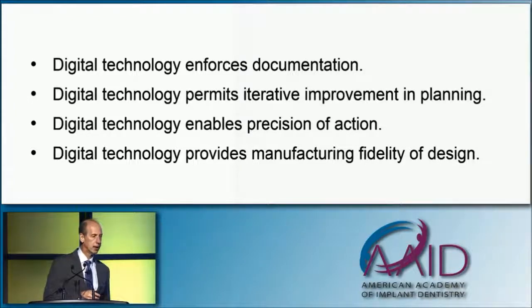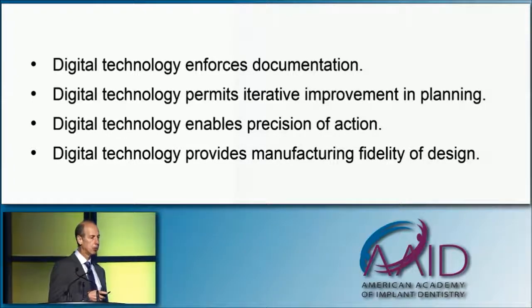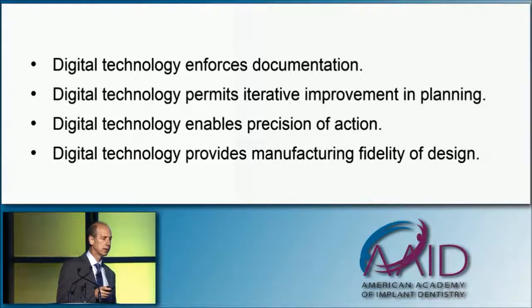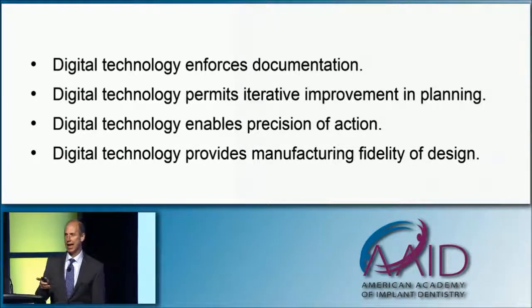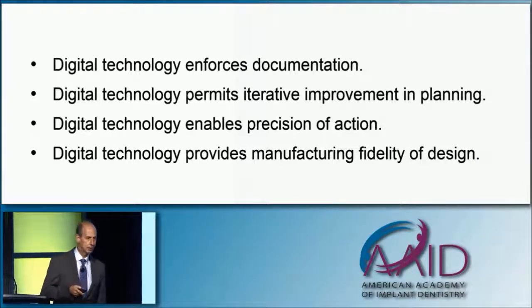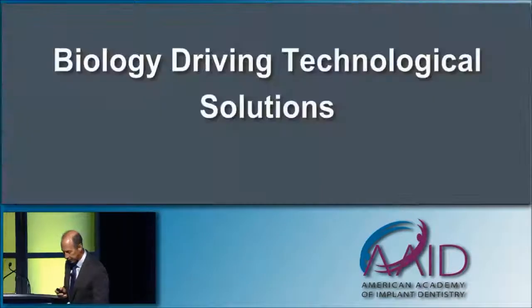Digital technology enables precision in action, and we're going to talk about the value of guided surgery as we move through the lecture. And of course, the part that we all appreciate is that digital technology provides manufacturing fidelity. It's absolutely clear that you understand that nothing in dentistry should be cast today. Anybody casting anything is missing the opportunity to really improve the quality of care. It doesn't mean everything is ceramic. You have to recognize that we can selectively sinter metals in a variety of forms today to make even better restorations than we could before.